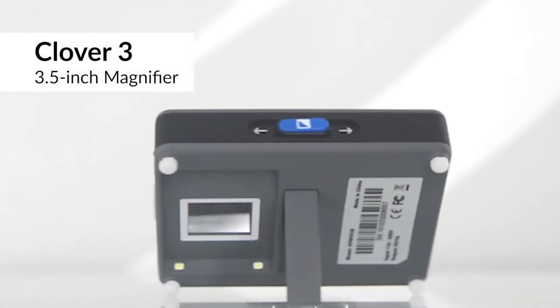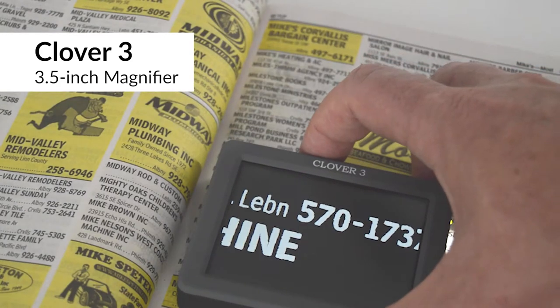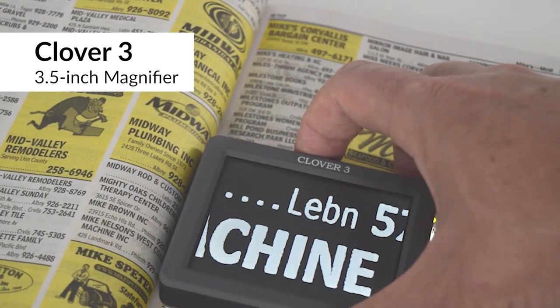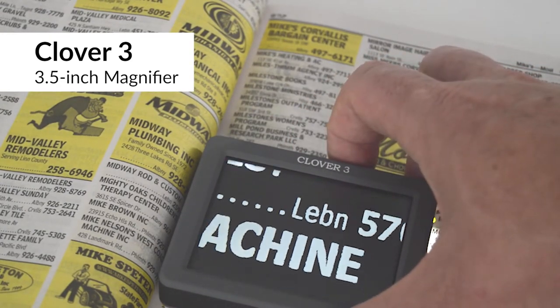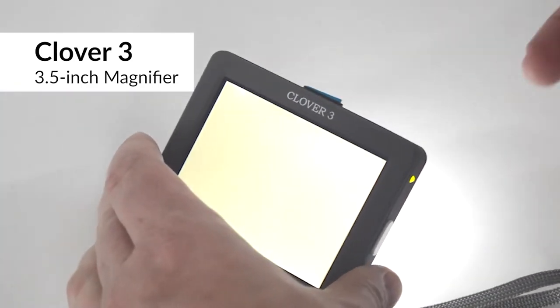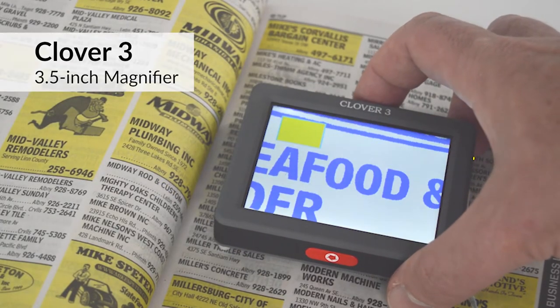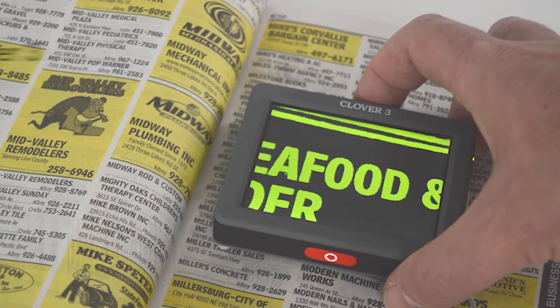The Clover 3 is the smallest and most portable of the Clover Magnifiers, weighing in at less than 3.5 ounces. Take it with you to the store to check price tags and always have it handy for quick reading. Pop out the writing stand and use Clover 3 to sign checks. Clover 3 gives you the main features of the video magnifier with only a few buttons to make it easy.